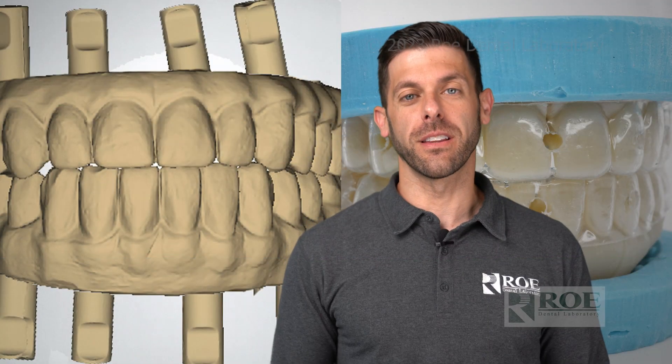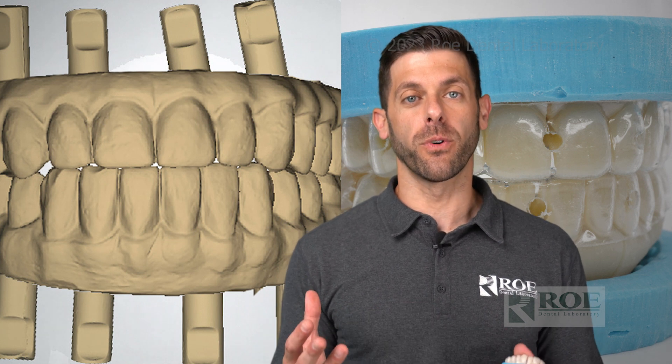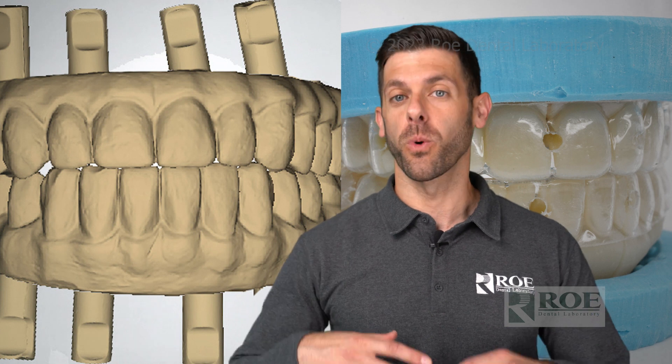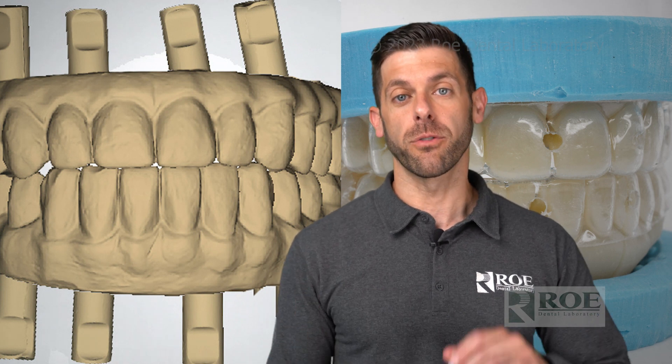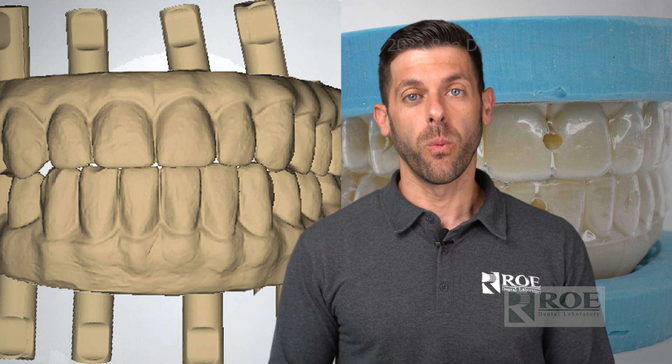Hey, it's Chris with Rho Dental Laboratory. We've put together a video series on restoring full arch. There are a bunch of different workflows for this and it can get kind of confusing. We're trying to make it nice and simple for you, from analog records to digital records. In this video we are discussing a digital workflow.